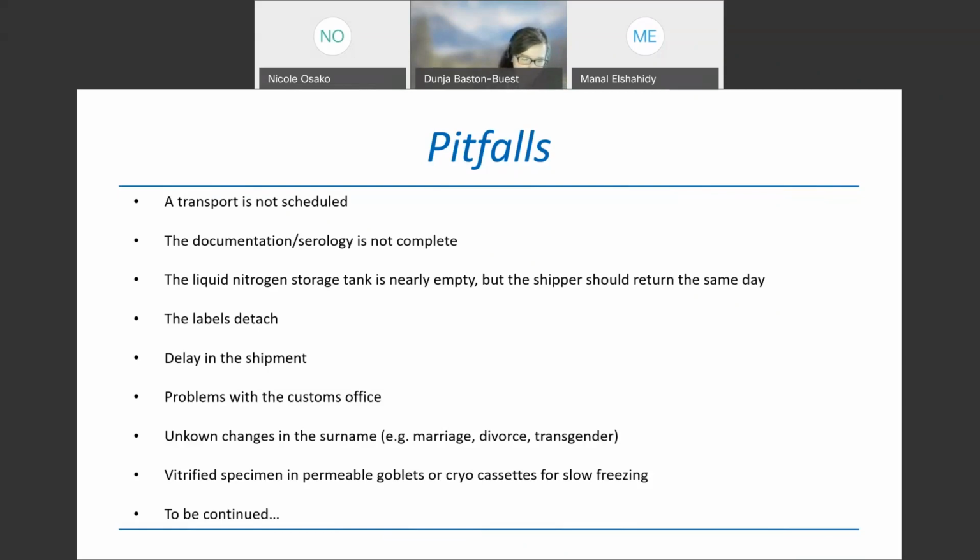And yes, it happened yesterday. So yesterday, the transport company just shipped it to the other infertility center here in Düsseldorf and didn't inform us. So we waited for this transport to arrive and it didn't. And we needed to pick it up. And that might happen too. There might also be problems with the customs office in case you export abroad.